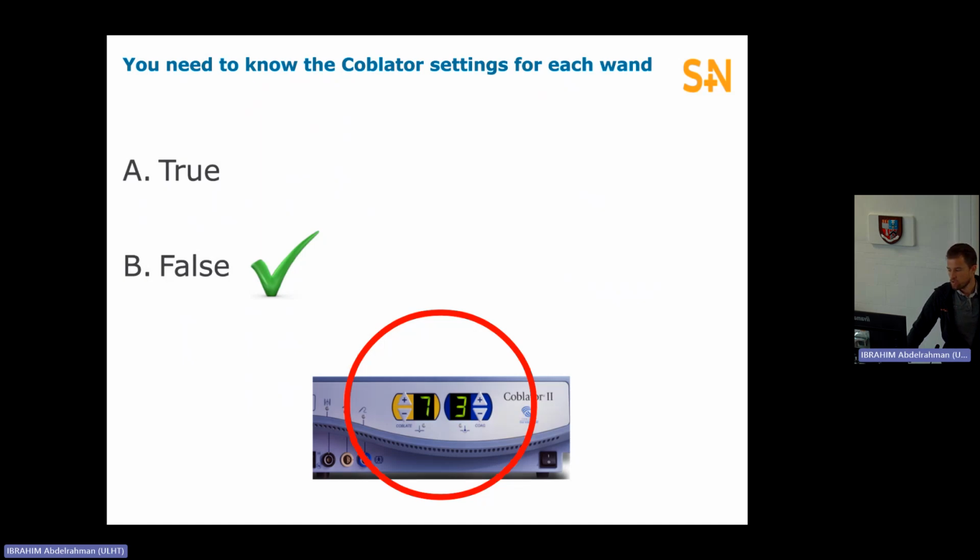So on your learning curve, if you're new to coblation and you're doing intracapsular tonsillectomy, we typically say, do 9, 7, 5, finish on the capsule. But once you've got a good level of experience, the anatomy well, you're comfortable with where the capsule is and how to use the device, most are high volume experienced users, they'll start on 9 and probably some finish close to 9 or even finish on 7.